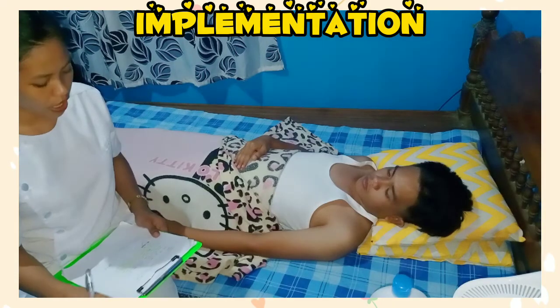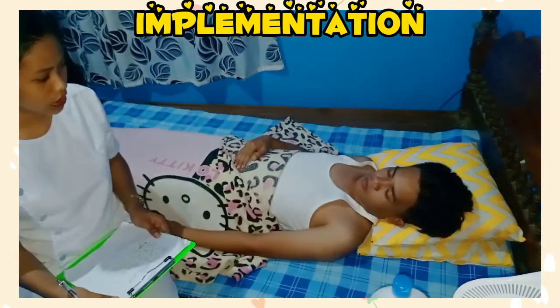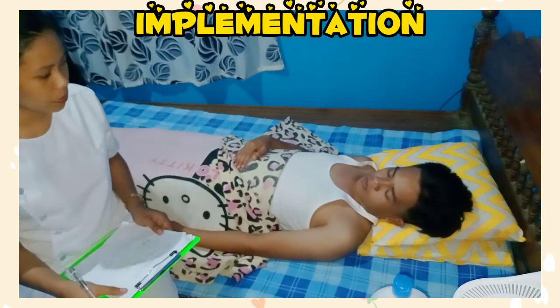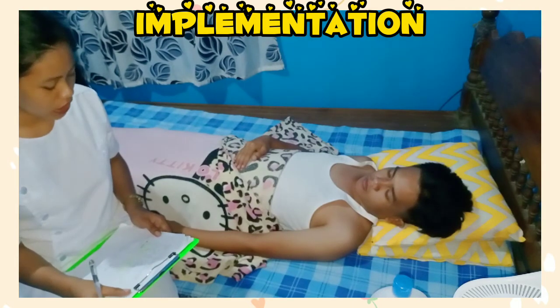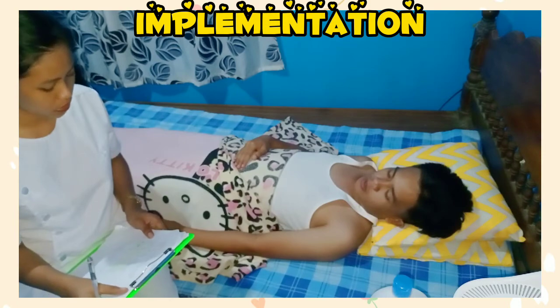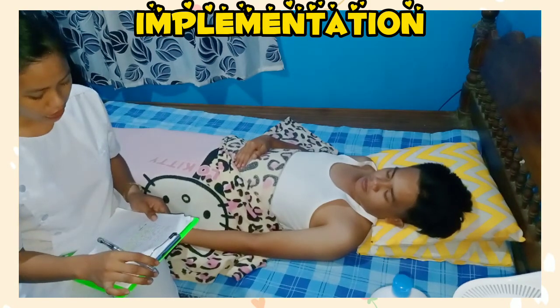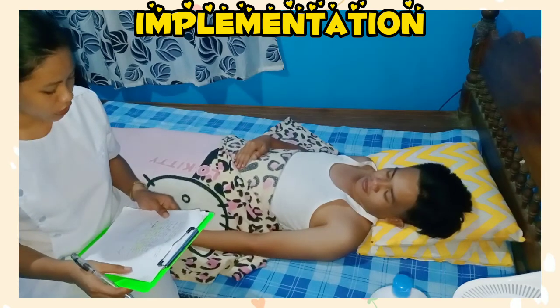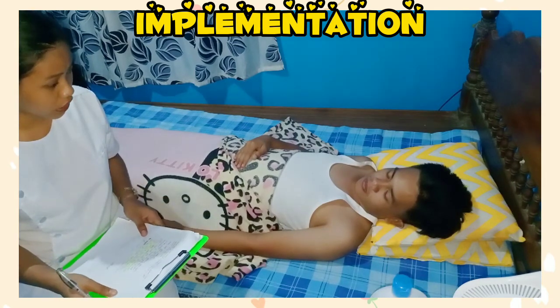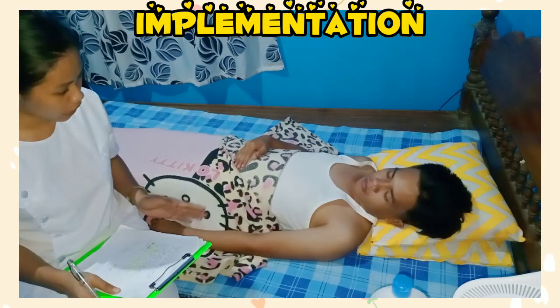Good day, sir. I am Jocelyn Carbonell from Nueva Ecija University of Science and Technology, and I will be your student nurse for today. So, can you please state your name, sir? I'm Jorel Carbonell. So, Mr. Jorel Carbonell, I will be getting your respiratory rate to know the number of breaths you take per minute. So, before that, let me perform hand hygiene.